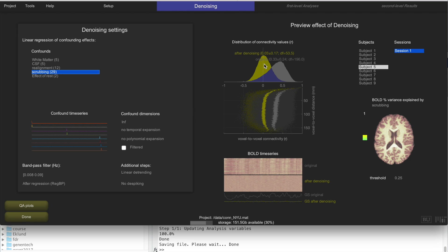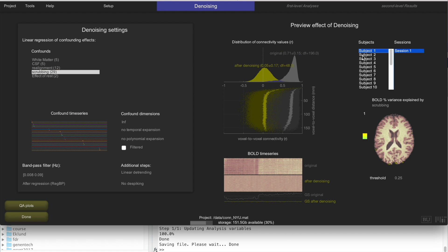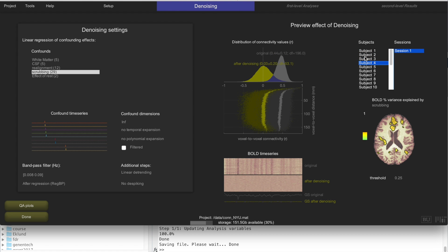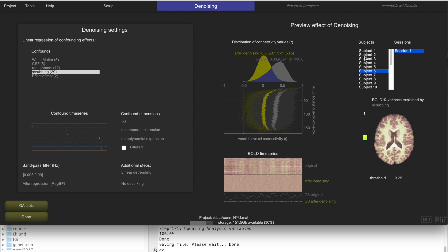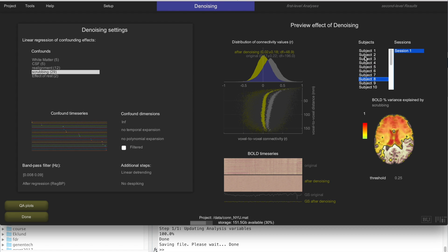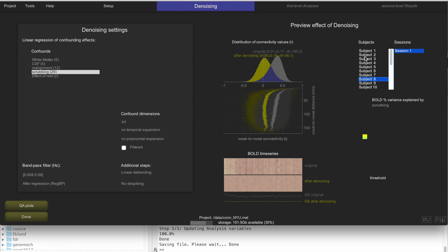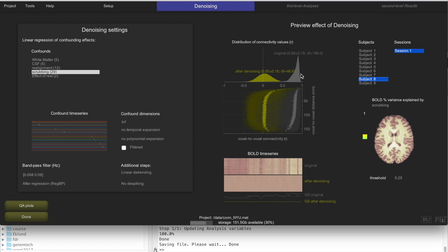The effect that denoising has on functional connectivity measures is very beneficial. After denoising, the distribution of voxel-to-voxel correlations looks very similar across all subjects and is reasonably centered around zero, which is what you would expect. All the huge differences between subjects driven by noise effects have been removed. This is how you evaluate whether denoising is doing what you want: look across subjects, and if distributions are reasonably centered and similar, you are fine.